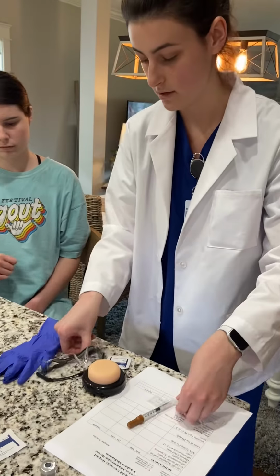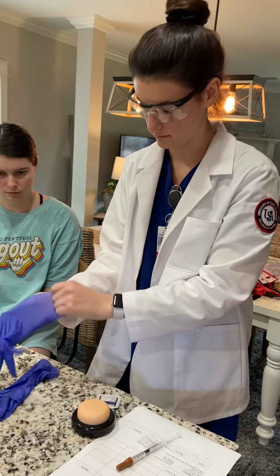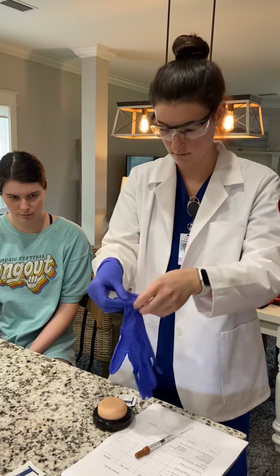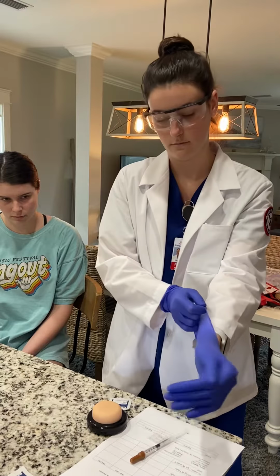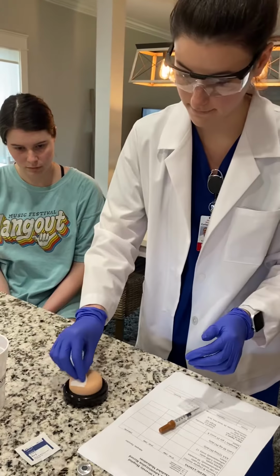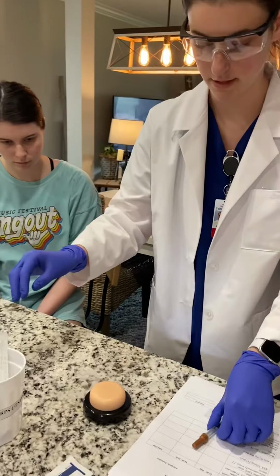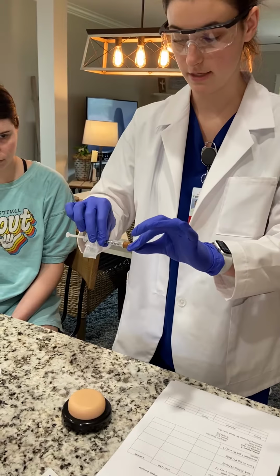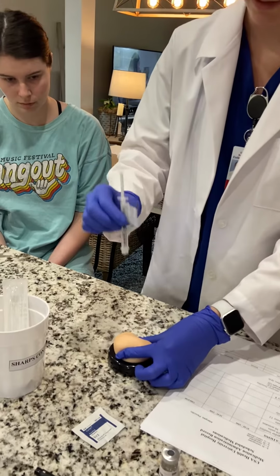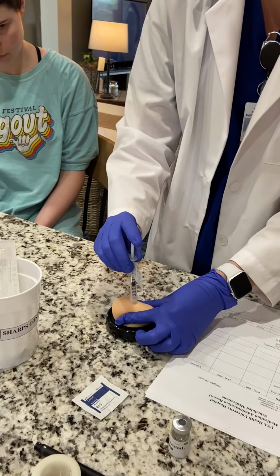So now I'm going to put on my goggles, and I'm going to don my clean gloves. And now I'm going to clean my injection site. Okay, and now I'm going to administer my medication subcutaneously, which means that I'm going to pinch the skin and I'm going to inject it 90 degrees, injecting my heparin 0.5 milliliters.